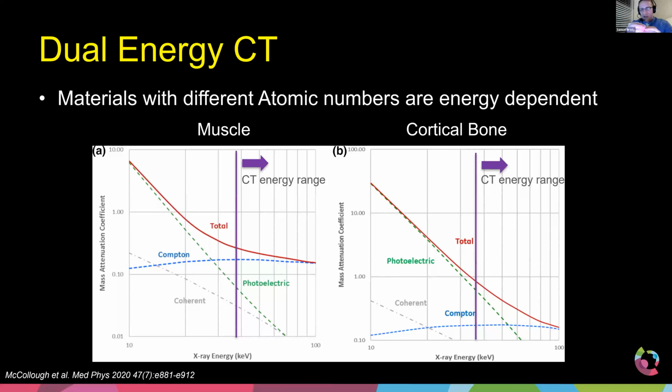It'll either fully attenuate, and that's why that tissue looks white, such as bone, or it might pass through the body and go straight to the detector, and therefore it'll look black, such as air or areas of lung tissue. And so what we're basically doing is we're measuring the attenuation effects as the radiation passes through each voxel or each part of our body.